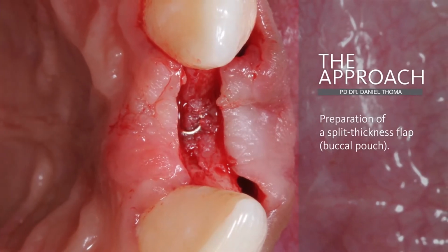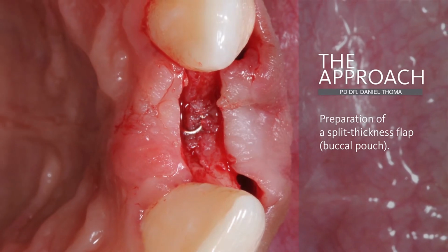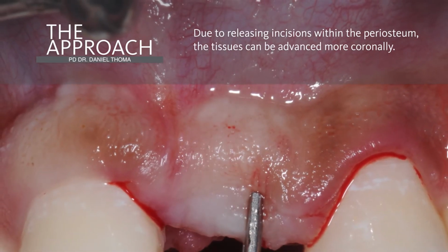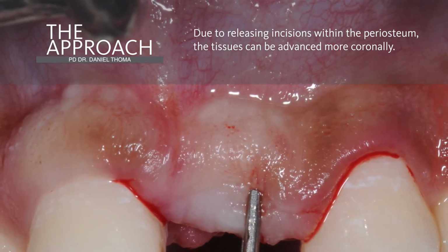As a first step to perform the soft tissue grafting procedure, a split thickness flap is prepared crestally on top of the implant, but also on the buccal side. Following the preparation of the split thickness flap, we can see, also due to the releasing incision in the periosteum, we are able to advance the flap more coronally.